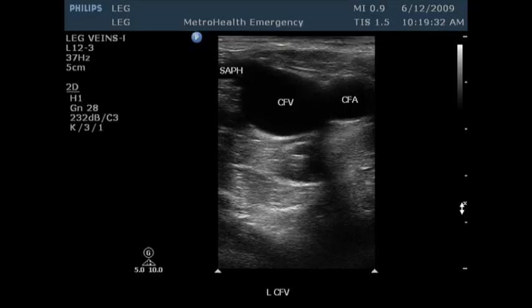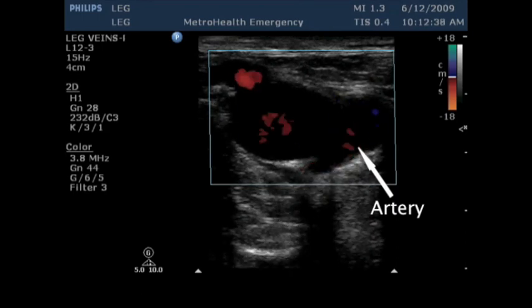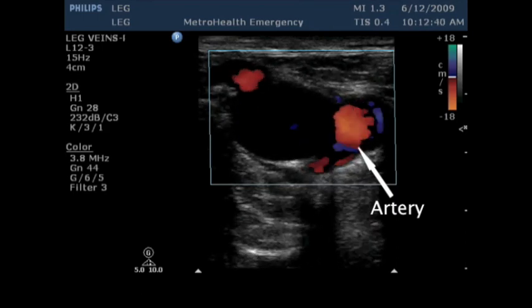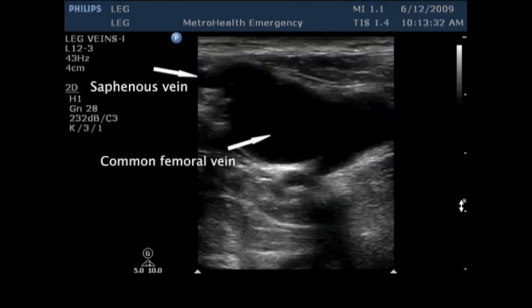The femoral vein and artery are seen as 2 circular anechoic structures. The vein is medial or sometimes posterior to the artery and is usually a larger, thin-walled structure. Color Doppler may be used to briefly, positively identify the pulsatile femoral artery and confirm identification of the vein.